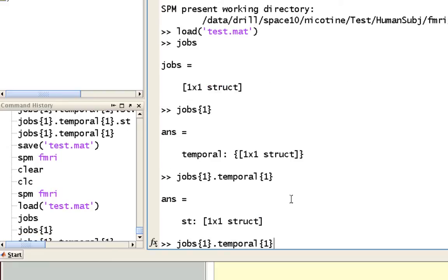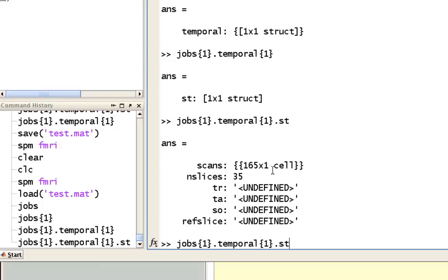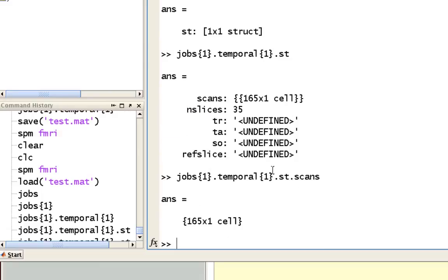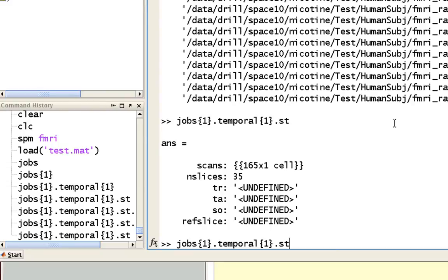And you see it's temporal, and there's another field, ST, which stands for slice timing. Now all these features here are the different aspects of the slice time correction that you saw in the graphical user interface. Now we already filled in all those scans, as you can see here. So all of those different files that we selected. And we also filled in the nslices.